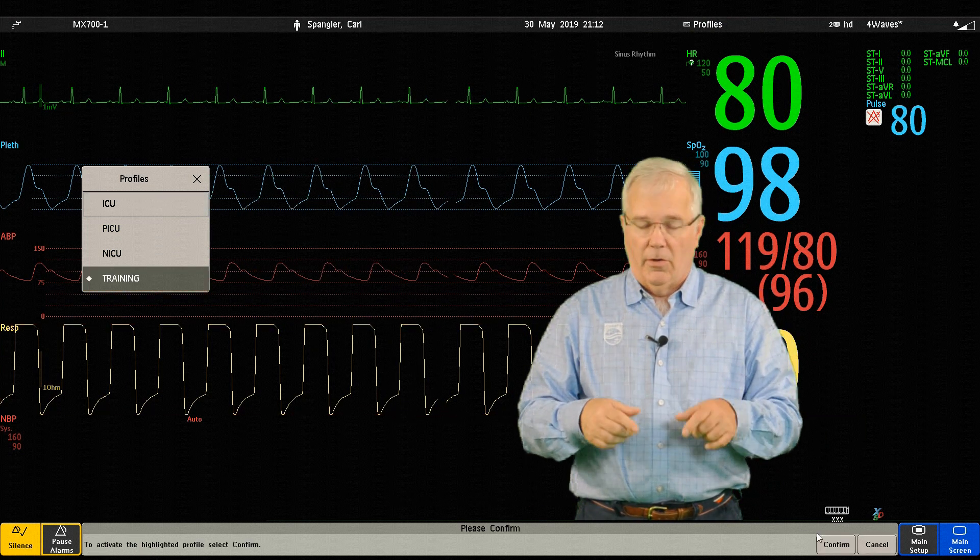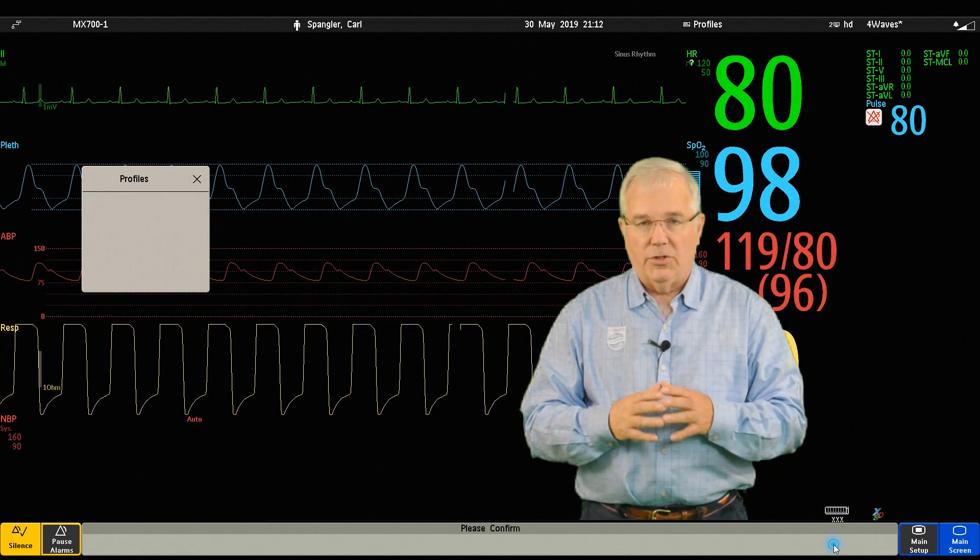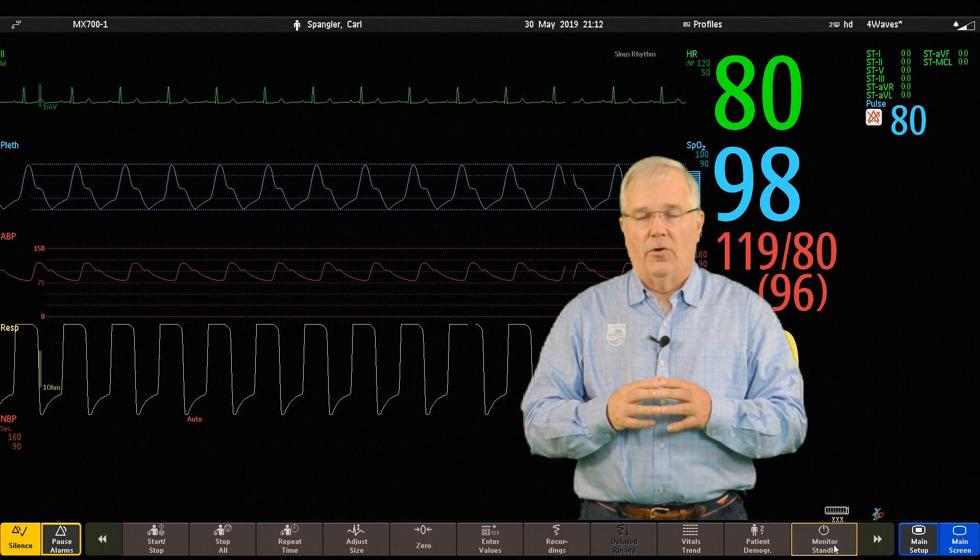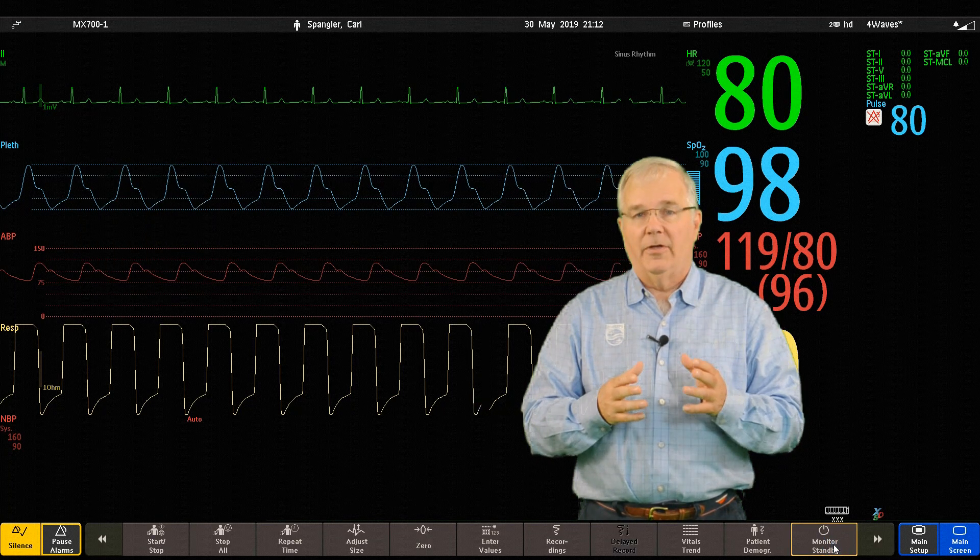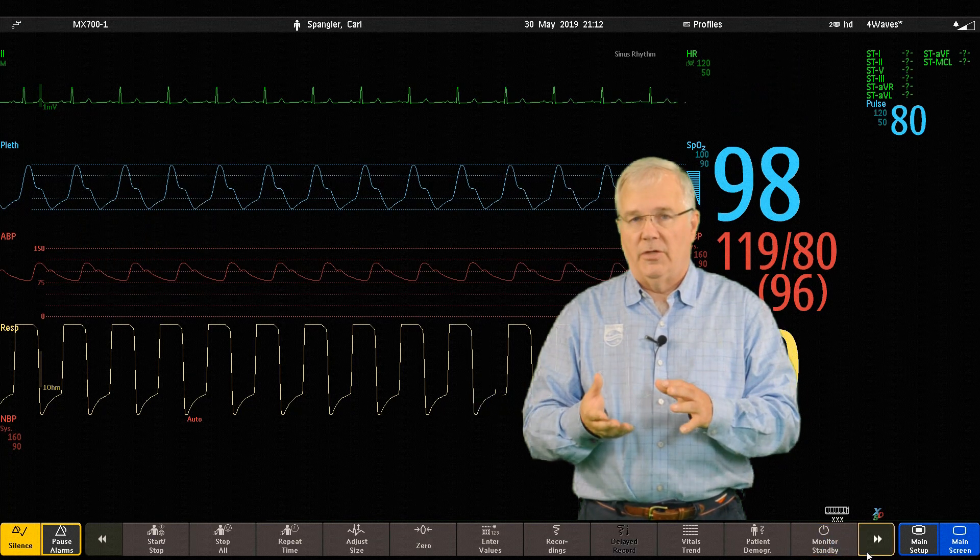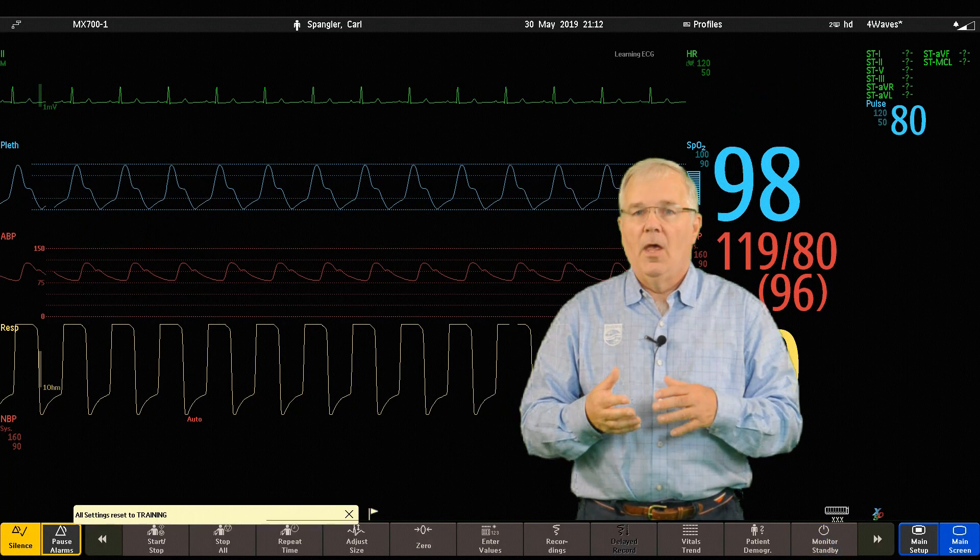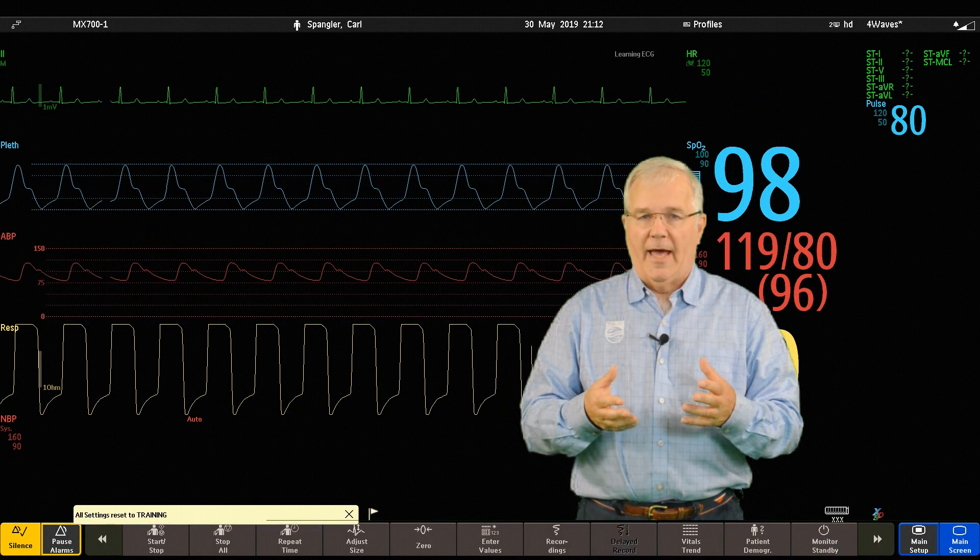Now down in the smart key area, you'll notice it changed to confirm. You have to confirm to change the profile. Once you've done that, the profile will change.